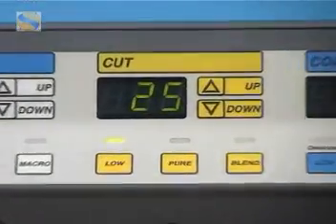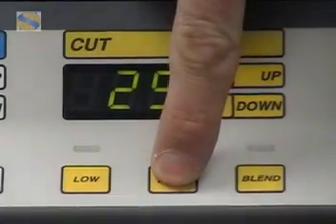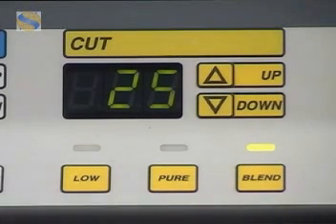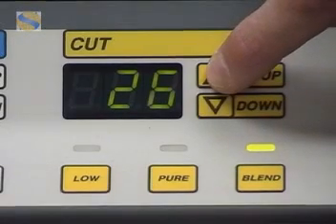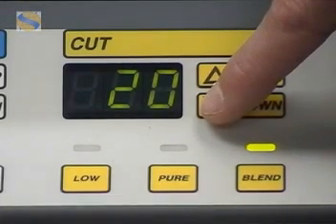The next mode we'll look at is the monopolar cut. The low setting is useful in laparoscopic work. Pure is used 90% of the time in the cut mode. The blend mode provides cutting with hemostasis. Again, the power is easily adjusted using the controls adjacent to the numeric display, with a maximum power of 300 watts available in cut mode.